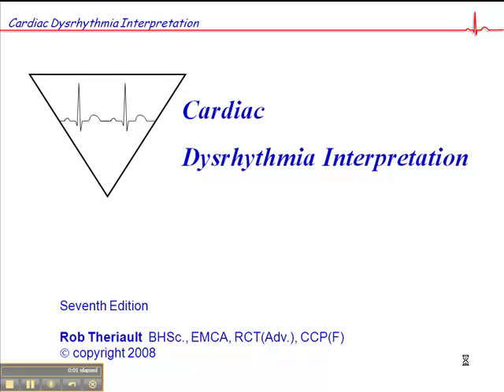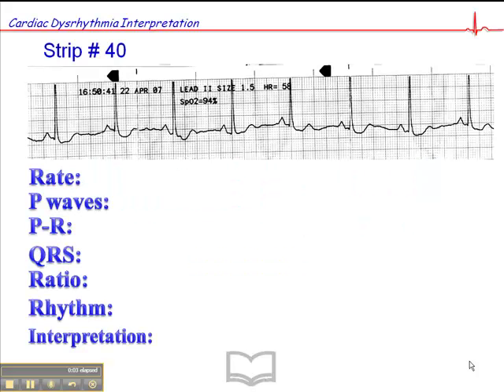We're on page 104, and this is exercise 40. The heart rate is approximately 60. You notice that the heart rate here says 58. Let's just do a quick count.